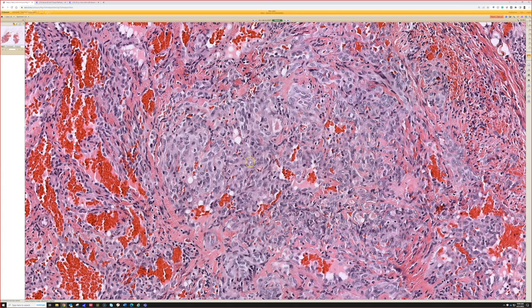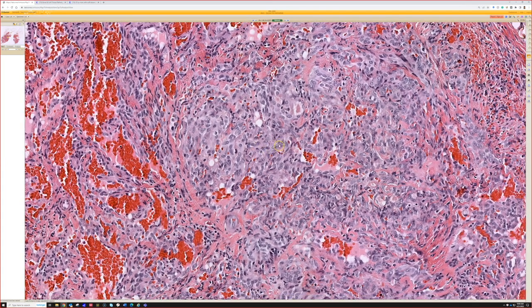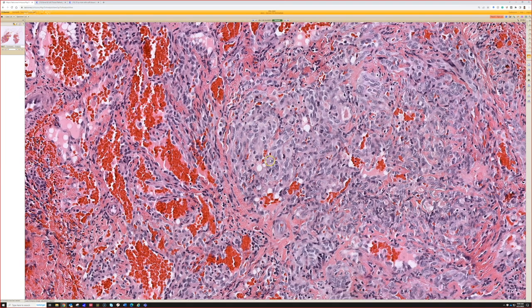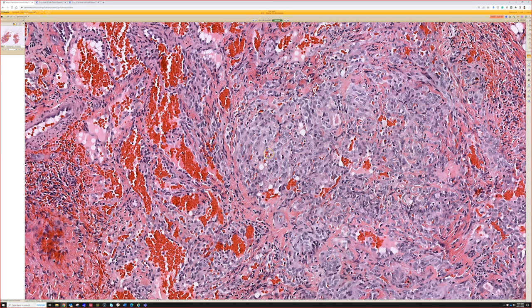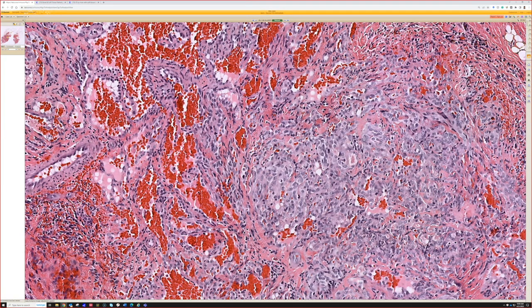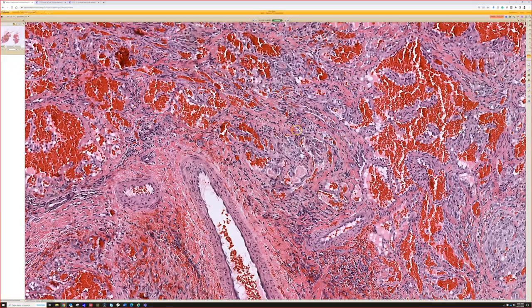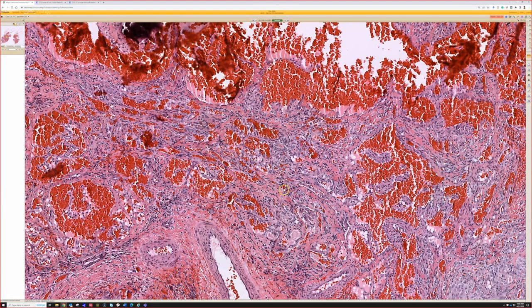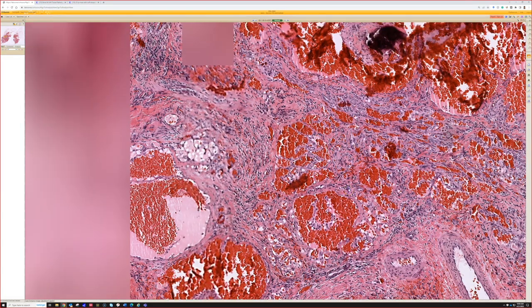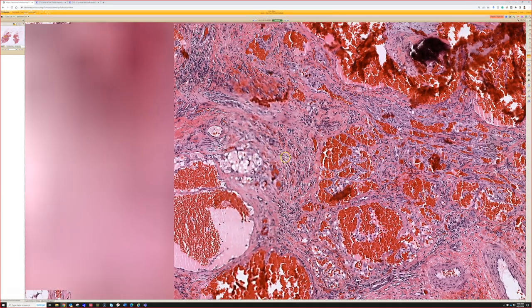One important thing: this is an entity where CD34 is often negative in much of the lesion. Even though these are vascular, they often do not express CD34, or have large zones that are CD34 negative. This is yet another reason not to rely on CD34 as a vascular marker in general. My resident Raheel Rizman was the first person who showed me an article in the literature about this. I hadn't stained these very often because usually, if you have a nice sample, they're pretty recognizable once you're aware of their features.